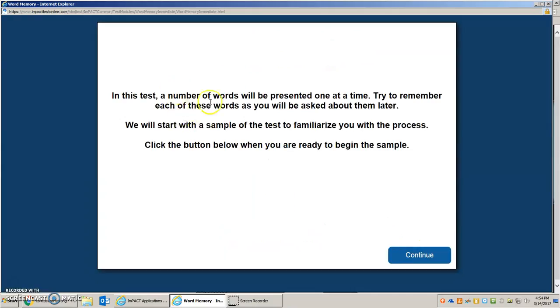Click Next, and you will get the directions here about the neurocognitive testing. Please make sure you read all the directions. Like I said, sometimes they will ask you to click the numbers in ascending order, and sometimes in descending order. Okay, so always read the directions. When you finish, it will ask you about printing something or emailing something. Just close the window. You do not need to print anything or email anything. I can access your testing once you have finished and logged out. Okay, speaking of, when you finish, close the window, and that's all you have to do. Good luck.